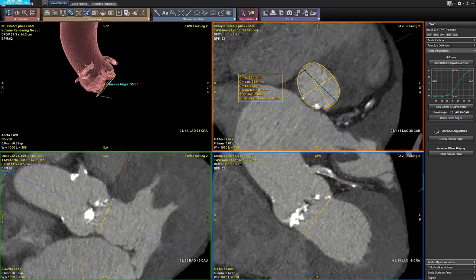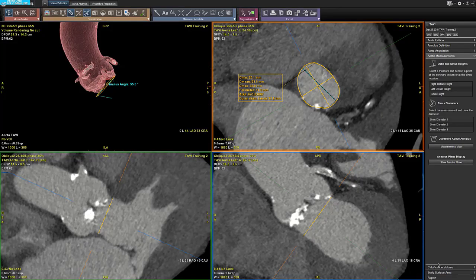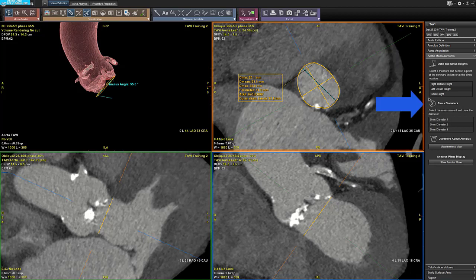We will proceed where we stopped in the video tutorial TAVI Analysis Part 1 and we will start with the aortic measurement step. There are three measurements in this step: the ostia and sinus height, the sinus diameters, and the diameters above annulus.